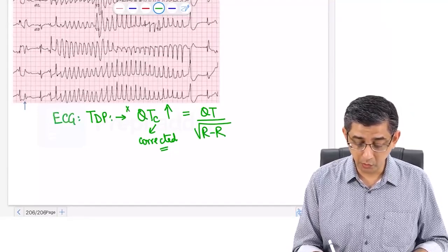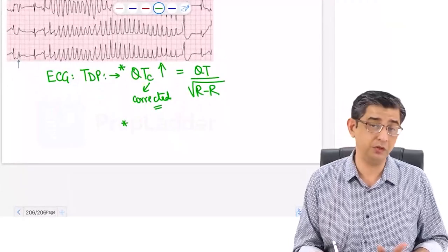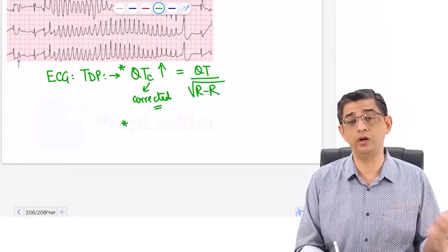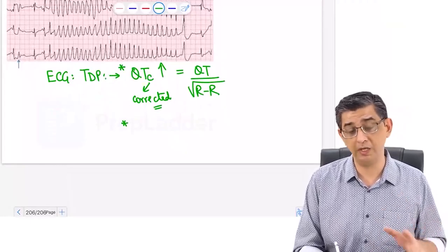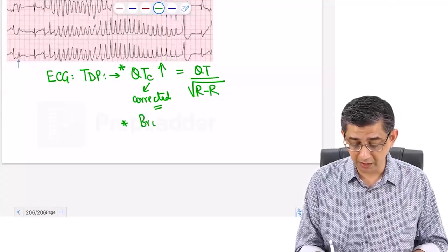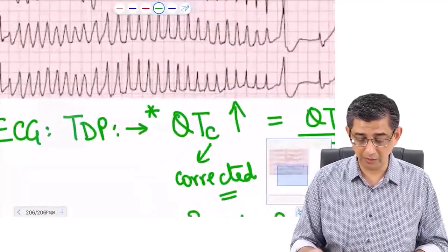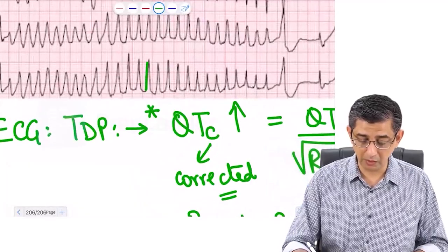Whenever you read about QTC prolongation, that's an important or easy way to crack this question of torsades de pointes, assuming that you're not able to remember the etiology of electrolyte imbalances or the drugs that I was talking about. Apart from this, the standard features will anyway be present and can be visualized in the slide at the moment. You can very well notice the QRS complex does not look like a QRS complex.